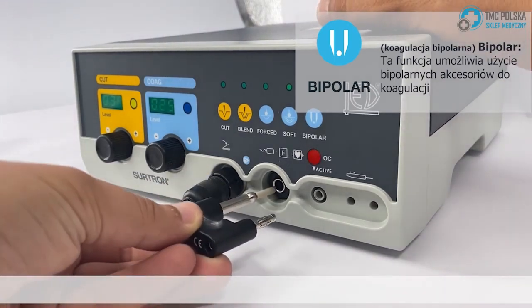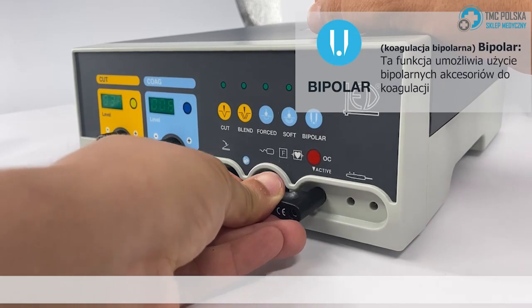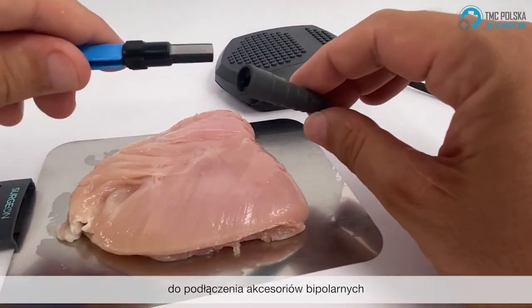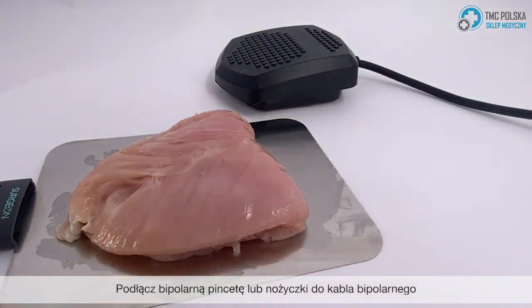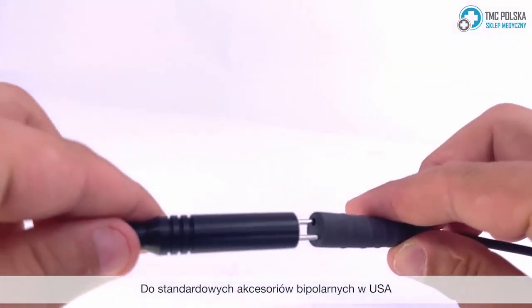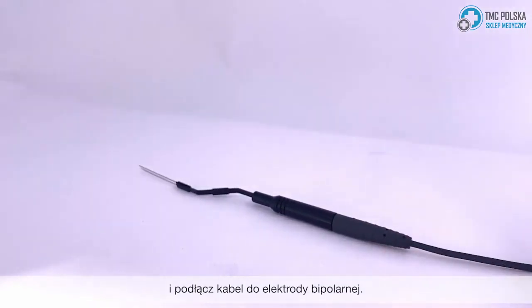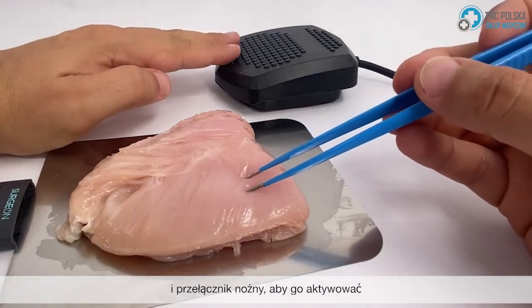Bipolar: this function allows you to use bipolar accessories for coagulation. For bipolar, you will need to use an adapter to connect any bipolar accessories. Connect your bipolar tweezer or scissor to your bipolar cable. For standard US bipolar accessories, insert the bipolar adapter to your device. Next, insert your bipolar cable and connect your cable to your bipolar electrode, then press the foot switch to activate it.